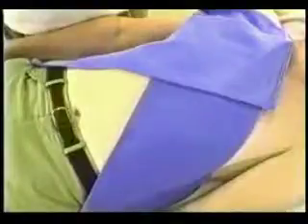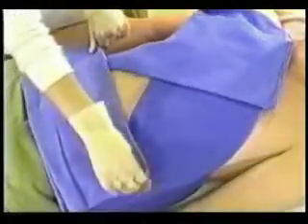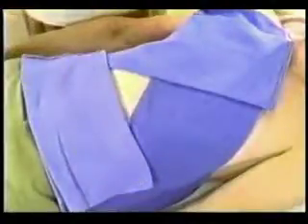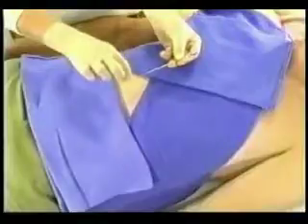When sampling deep, non-palpable lesions visualized by radiologic image or by ultrasound, I suggest a slightly different approach. After the skin has been cleansed thoroughly, the area is draped with sterile towels. Sterile gloves are used so that both hands can be used to guide the very pliable needle as it travels through the tissue.